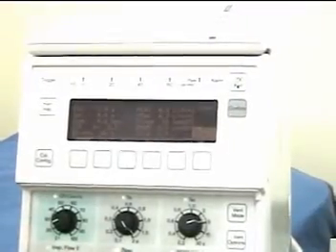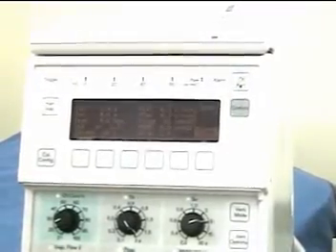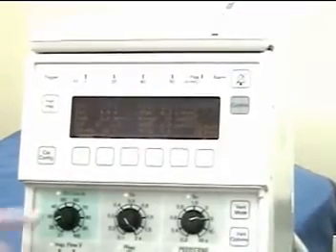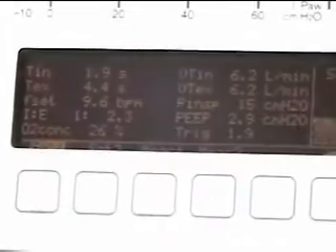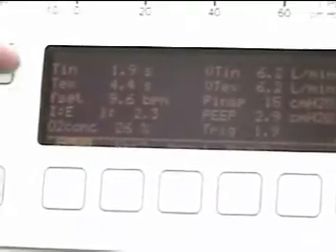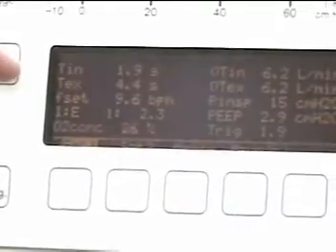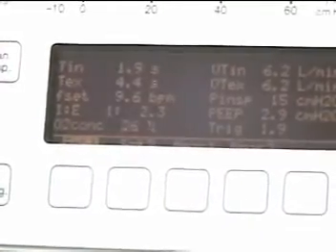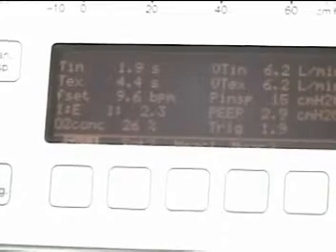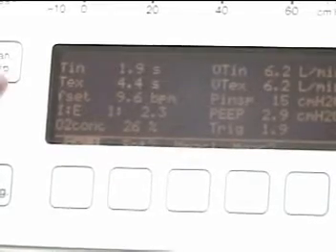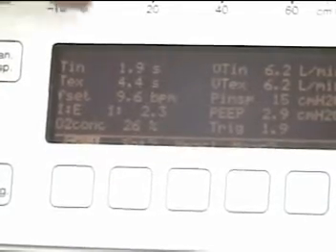If I want to know exactly what is being measured at the time, I will push the measure 1 button. On the screen you will notice inspiratory time, expiratory time, the number of breaths that have been set, the I to E ratio, and the oxygen concentration.